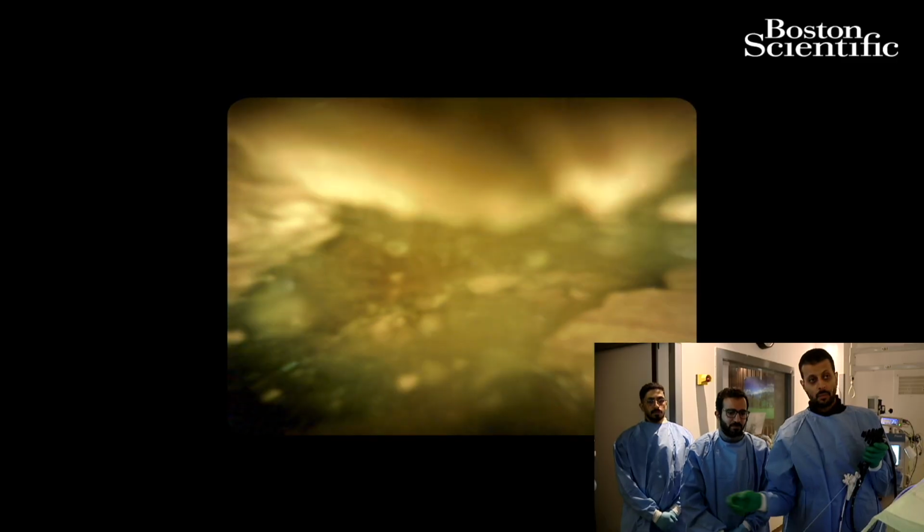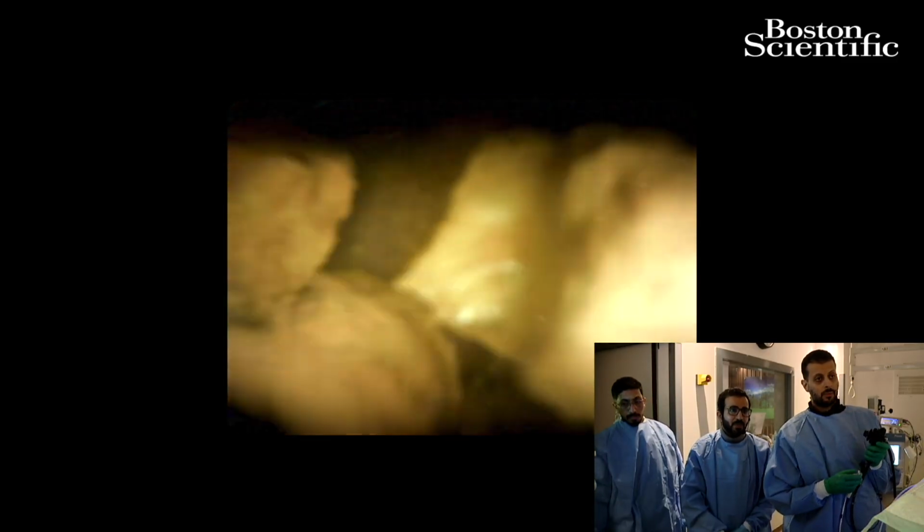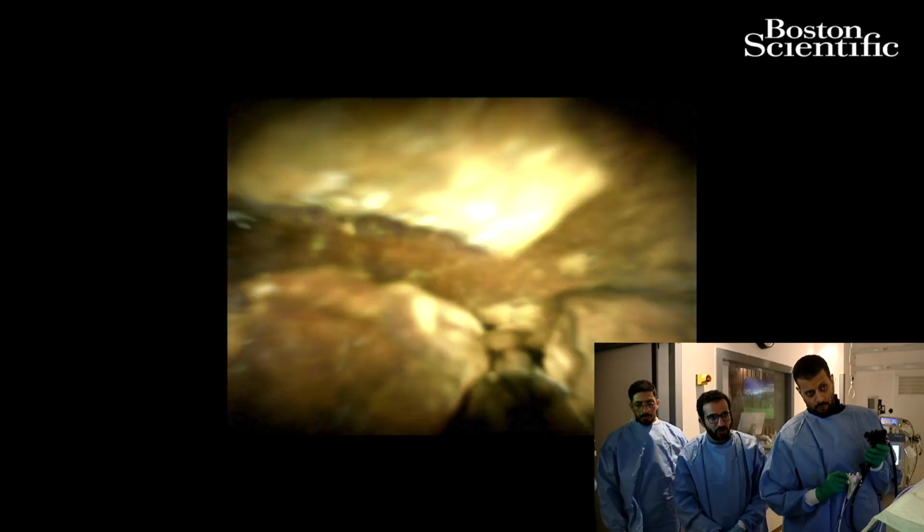Yes? There's a question from the audience. What is the EHL setting? So the setting is medium. We have low, medium, high power, and we have 10, 20, 30 pulses. So we use medium power and 30 pulses.